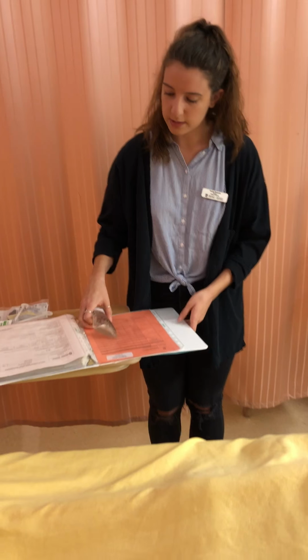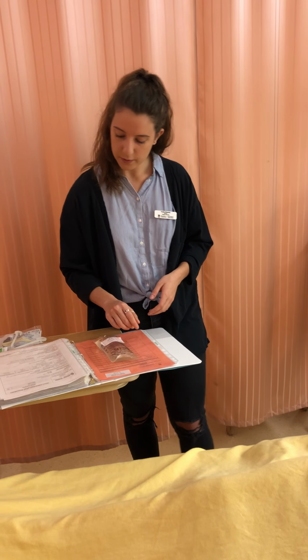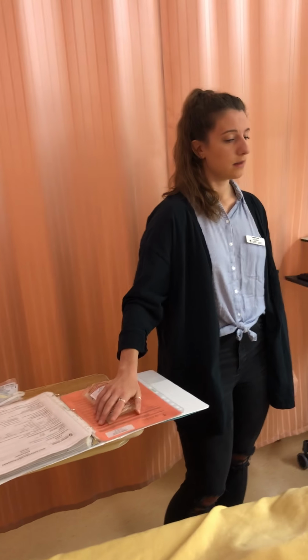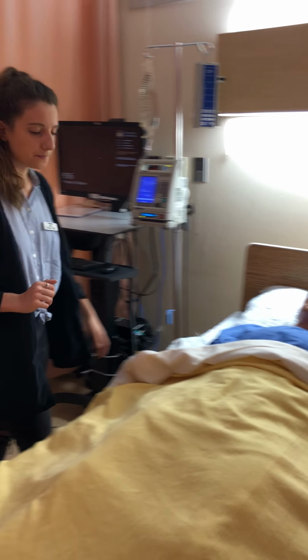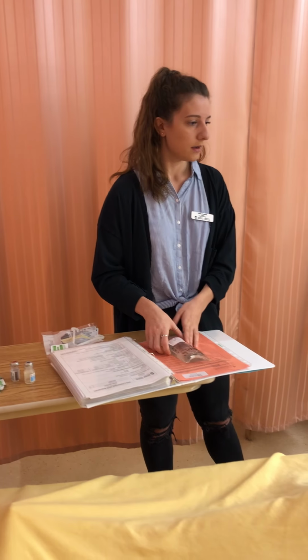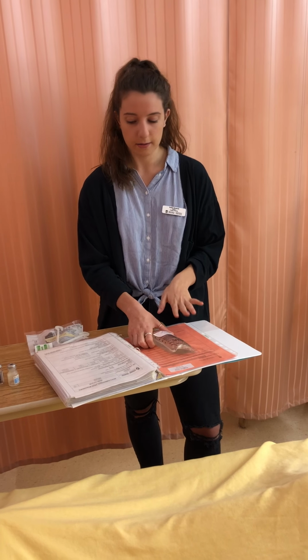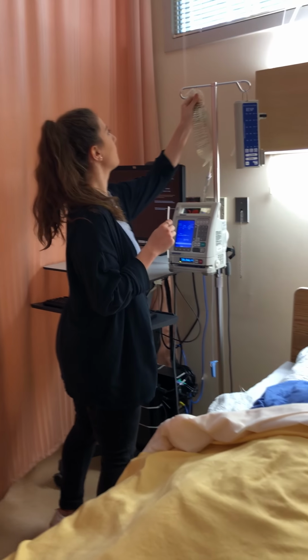Okay, Mrs. Wrightson, so I have your drug today. It's an antibiotic for your pneumonia. Let me know if you notice any nausea or vomiting. These are just some of the side effects that I will monitor for. Here's your call bell, just in case. So now, my patient has the right to refuse. They haven't, so I can go ahead. So I'm going to lower my primary bag.